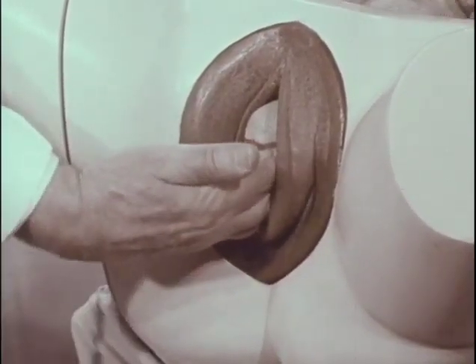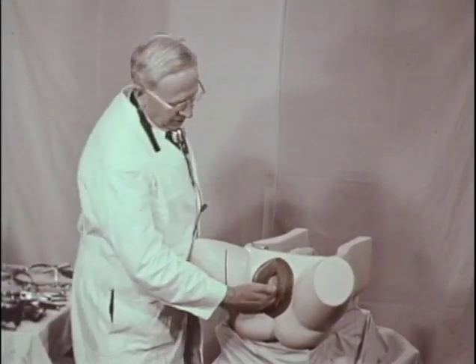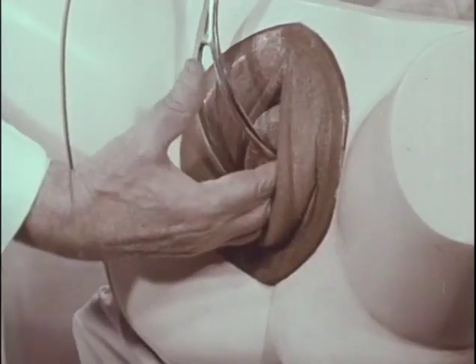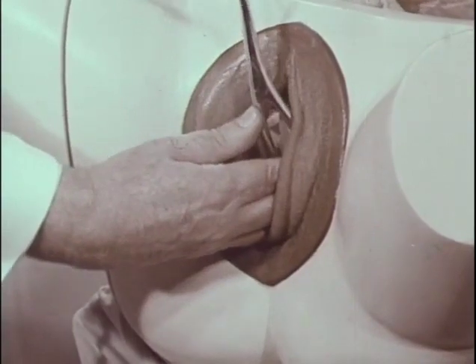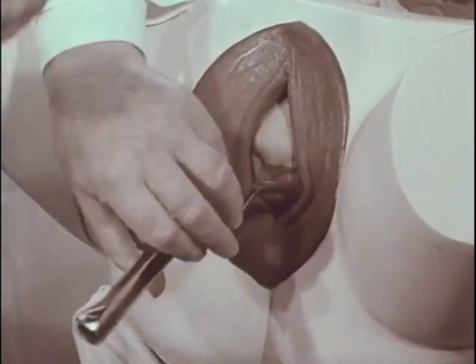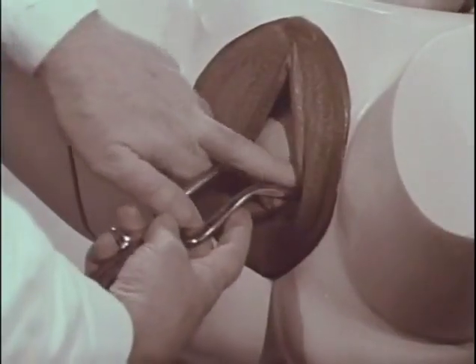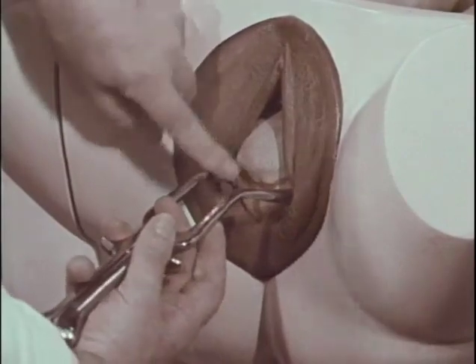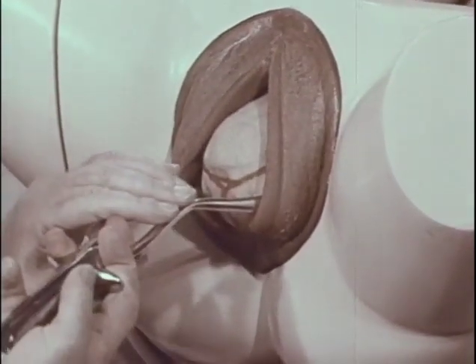Then the thumb is removed, with the fingers left in place to act as a splint to prevent backward rotation of the head, and also to act as a guide for the introduction of the left blade, the posterior blade, to the left posterior ear. And the right side, right blade, right hand, right side, directly into the right ear. Check the application. And it's found satisfactory, and the head is anterior. Proceed with traction.